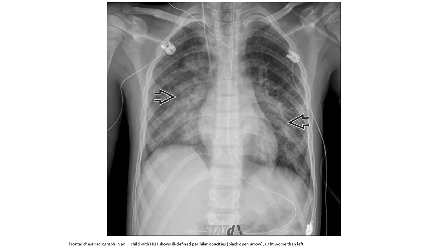Chest radiograph in an ill child with HLH shows ill-defined perihilar opacities, right worse than left.